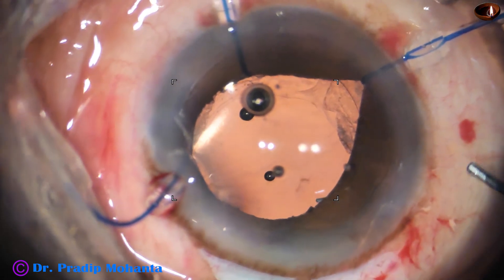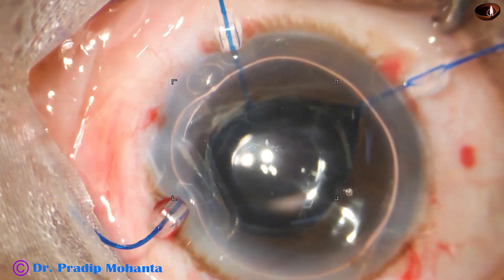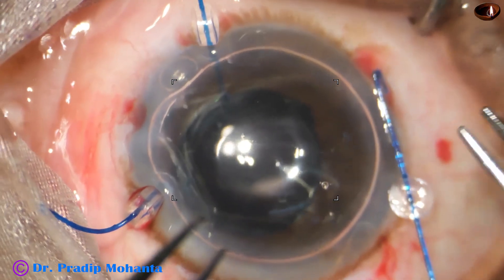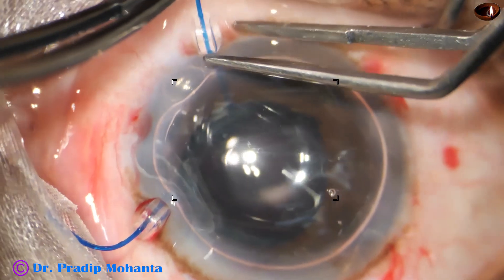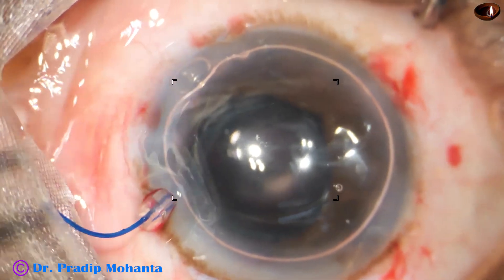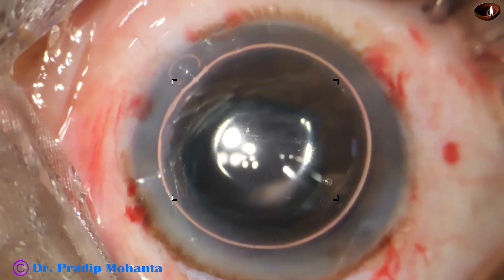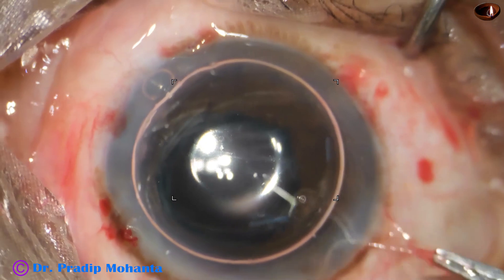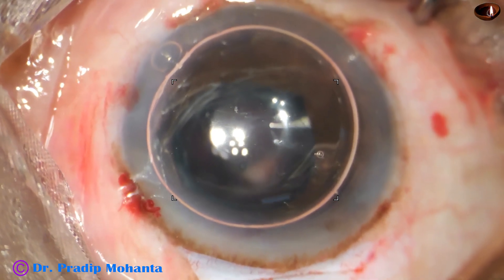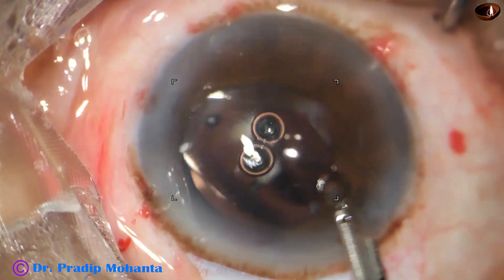This is nice centering of the intraocular lens. An air bubble goes in. Now I remove the iris hook which was at 7 o'clock, then the iris hook at 5 o'clock. See how beautifully we can remove the iris retractors with an air bubble inside — we do not have to inject visco to remove the iris retractors. And now is the final lavage to confirm the lens is very nicely centered.